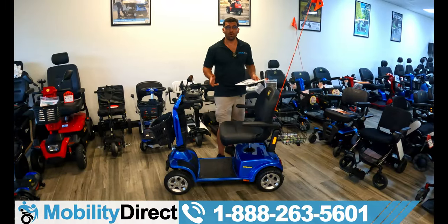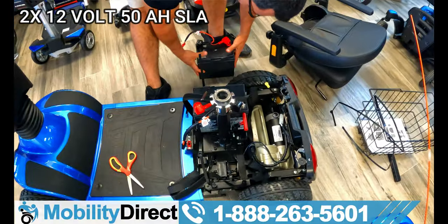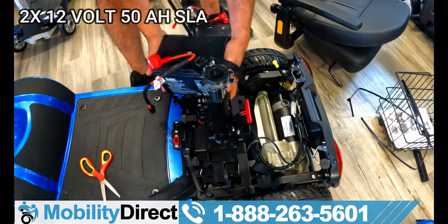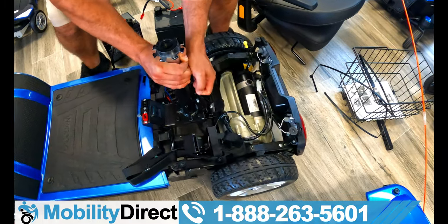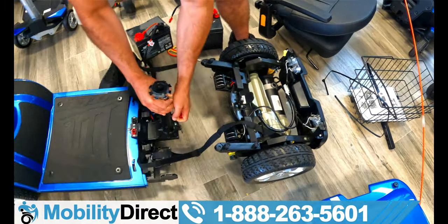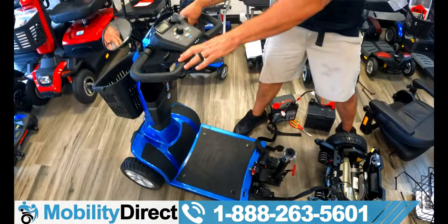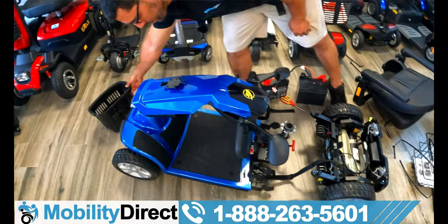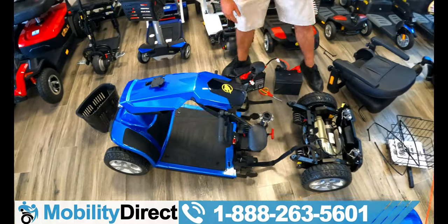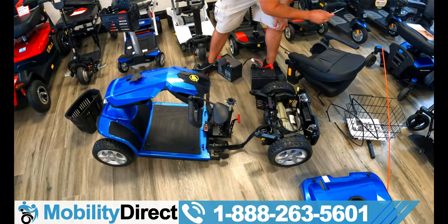As far as the batteries go, it has two 12-volt batteries — 50 amp hours each. They're pretty big and heavy, but the unit does come apart. If you want to transport it in the trunk of your car, you're going to need a pretty big trunk — ideally an SUV or a pickup truck. It's not a lightweight scooter, so you're going to need some muscle to pick it up. The front half detaches from the rear half.